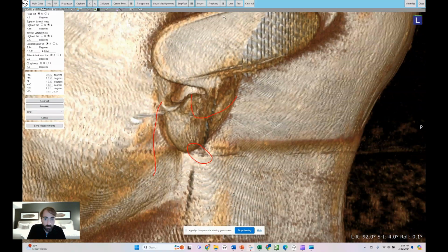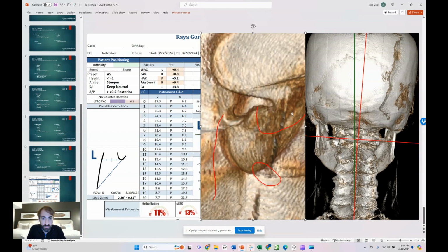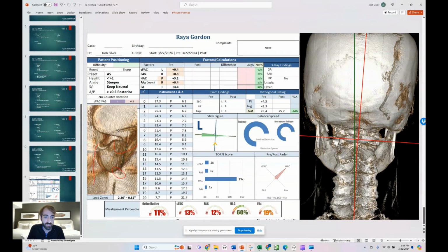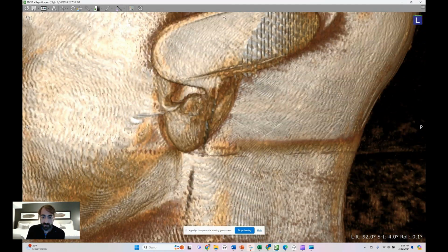For where do I aim the machine? And we'll post that one right here is where I like to put that. So this is how I like to do it because I use Epic. And I'm pretty much done. Time, about 14 and a half minutes. So we can jump back in real fast if we want.